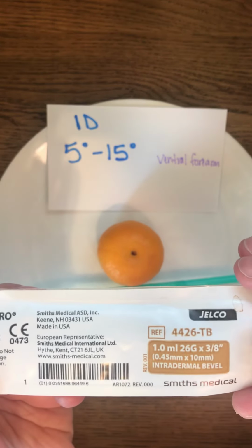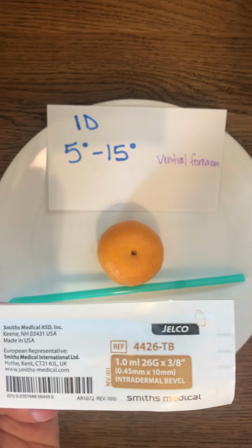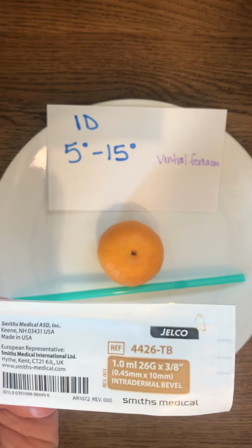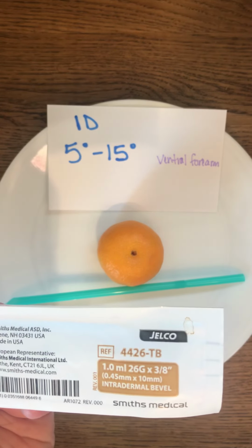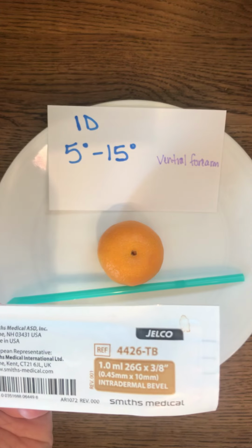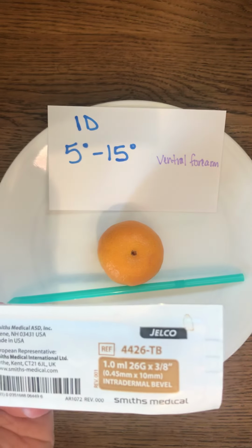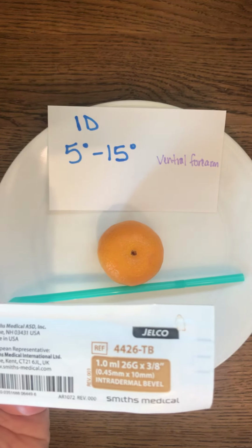You also want to have a very short needle, and you can see this one is 3/8 of an inch. Typically, the length of a needle for an intradermal injection is anywhere between 1/4 and 5/8 of an inch in length. The gauge is 25 to 28, and the angle that we are going to inject in is 5 to 15 degrees.